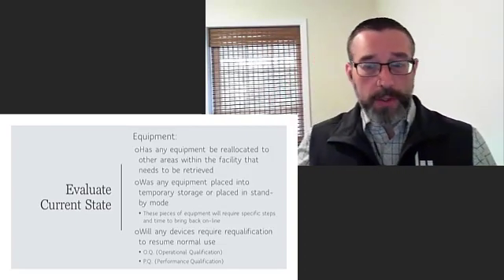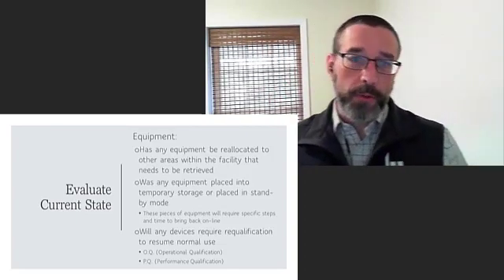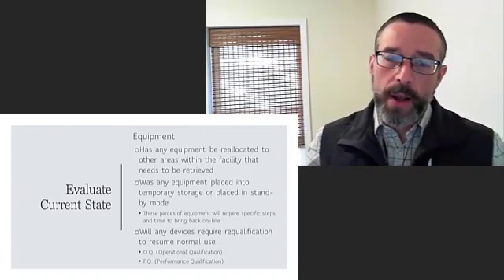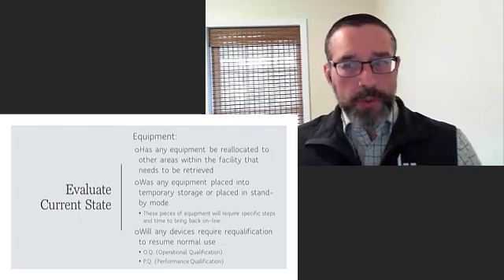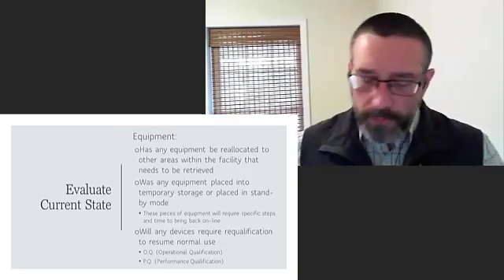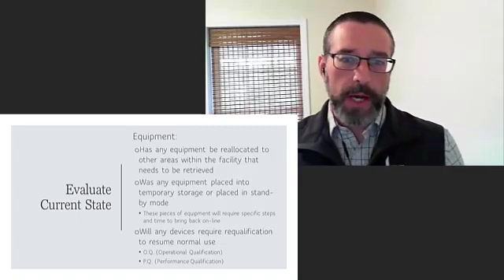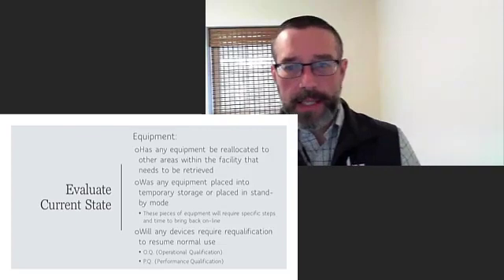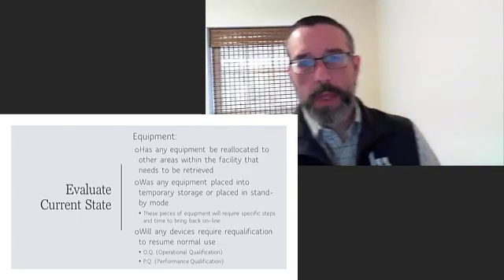We usually talk about dead legs for plumbing, and again, John's going to bring this up as it relates to endoscopy. We usually think about that specifically in plumbing and in reconstruction and refurbishment of areas of the hospital. But if you experienced a shutdown or a slowdown, is that something to consider as well?